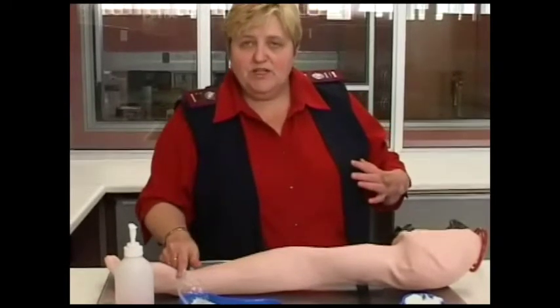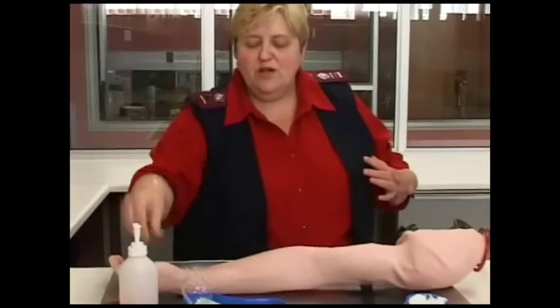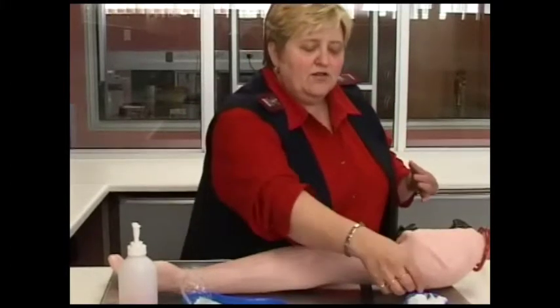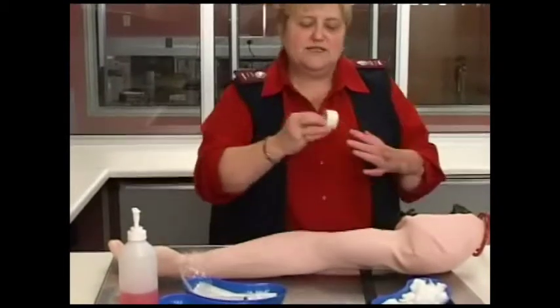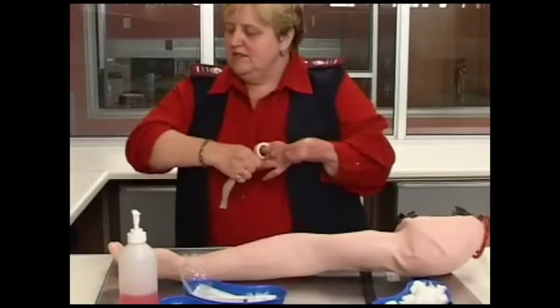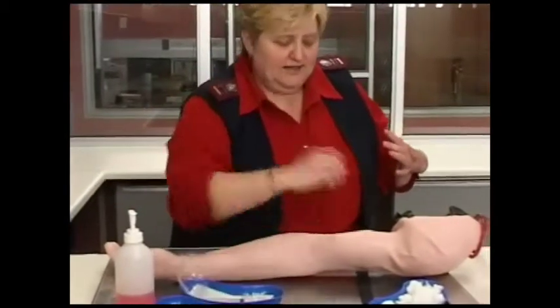You will first identify your patient and make sure they have the correct patient. Make sure you have the correct tubes where you want to put the blood. Make sure you have your cotton wool and a piece of plaster for afterwards to secure it when you have taken the blood.